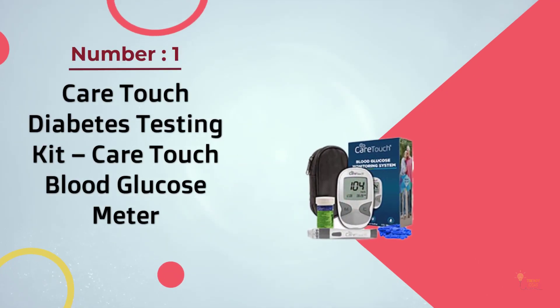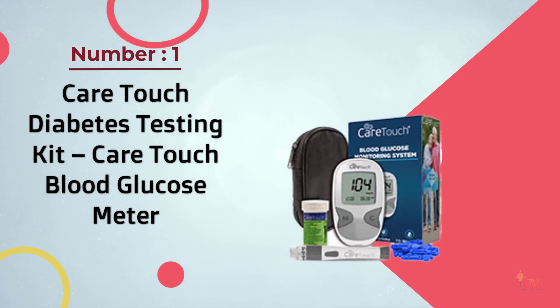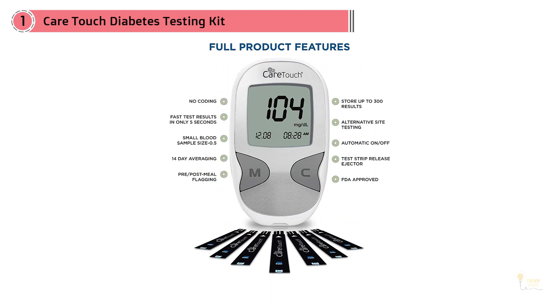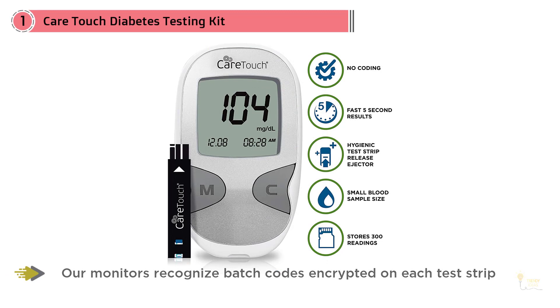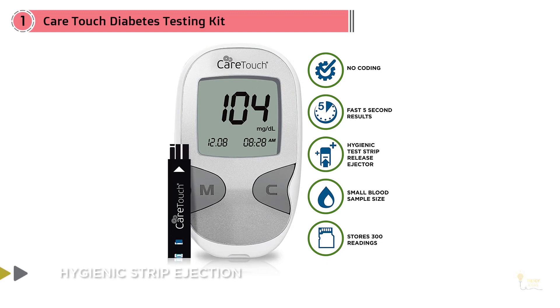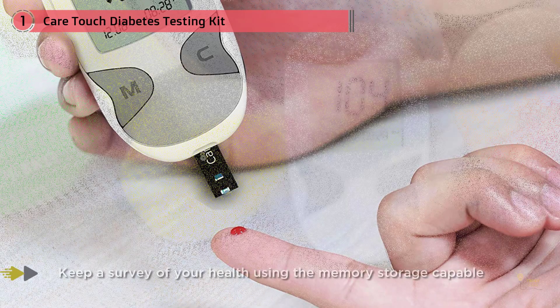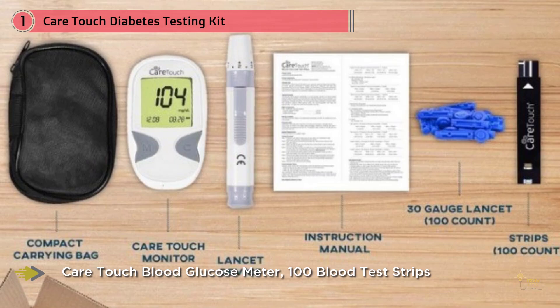Number one most popular: CareTouch diabetes testing kit, CareTouch blood glucose meter. This testing kit from CareTouch gets rave reviews from customers for its accuracy and ease of use. It can store up to 300 readings so you can monitor your blood sugar over time, and it keeps a 14-day average for short-term monitoring. This complete kit comes with a meter, 100 blood test strips, a lancing device, 100 lancets, and a carry case — everything you need to start monitoring your blood sugar immediately.